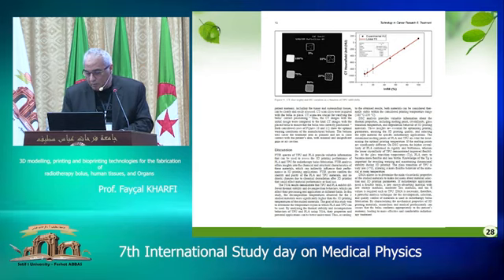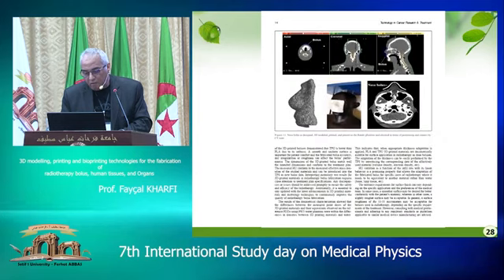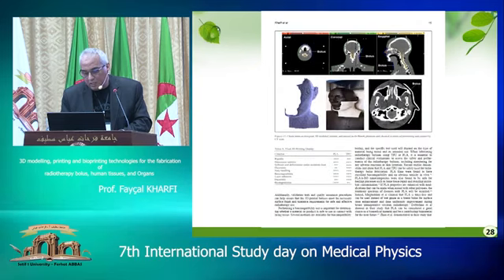So we study also this aspect. We check the surface roughness of the fabricated bolus. We check also the positioning of a different kind of bolus that we fabricate, and all this information is published in this paper.